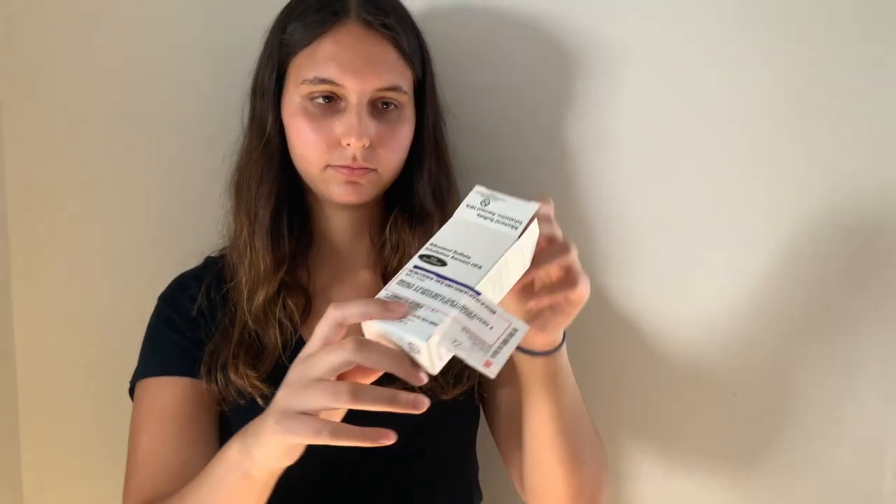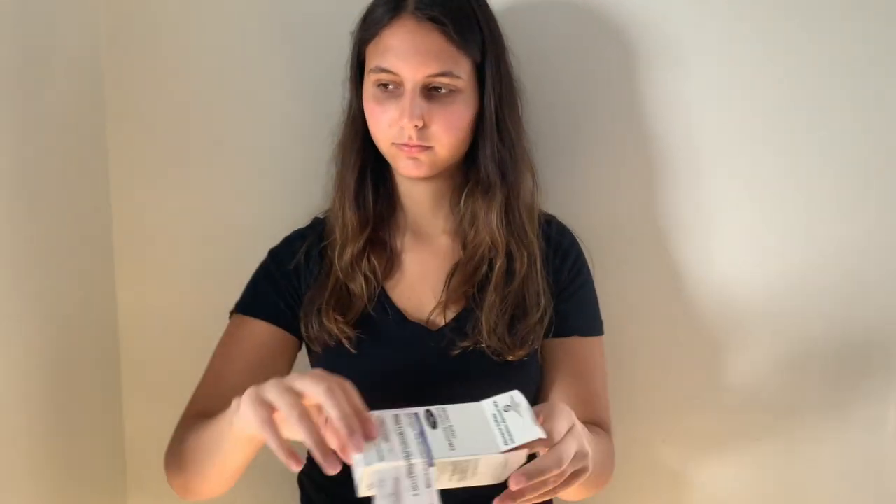Using an inhaler. Before you use your inhaler, you want to read the directions on the outside of the box. Only use an inhaler if it has been prescribed to you by your doctor. You want to take it out of the box and shake it well before using.